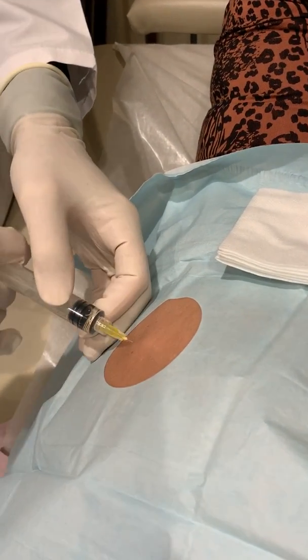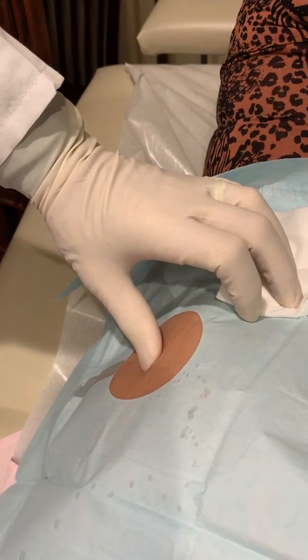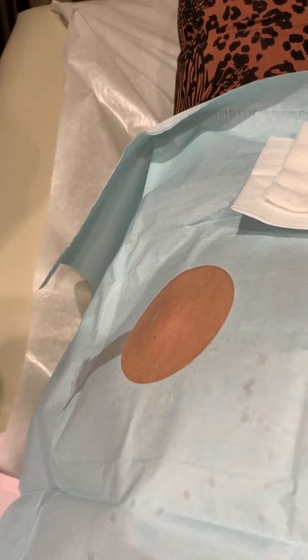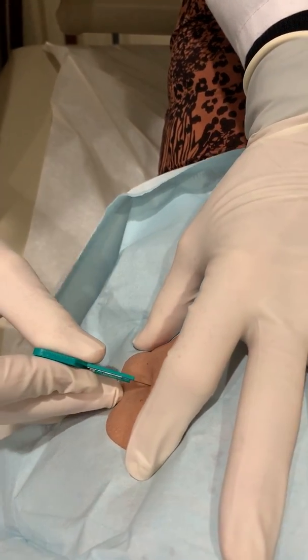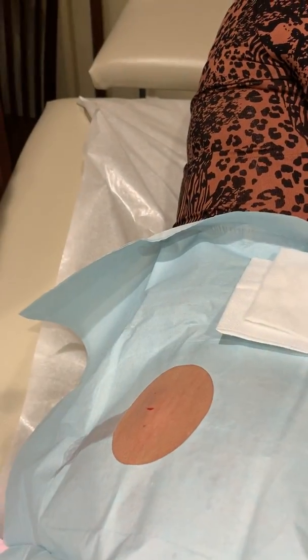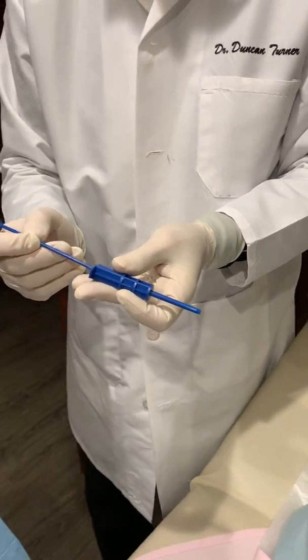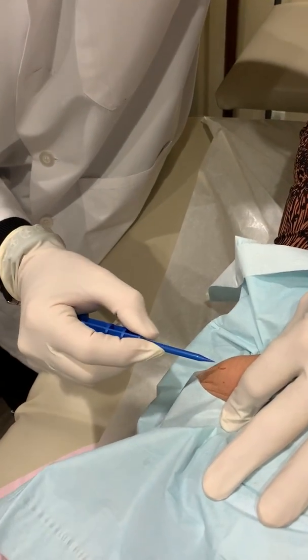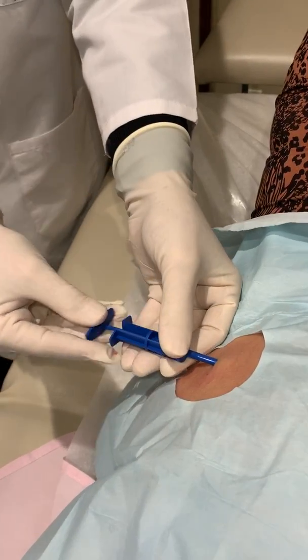The lidocaine has a little epinephrine in it, which decreases the chance of blood loss. We use a small number 11 blade to make a small incision, and then put the trocar — which will carry the medication into the tissue — grabbing hold of the tissue to get it in subcutaneously, going in about three or four centimeters in that area.